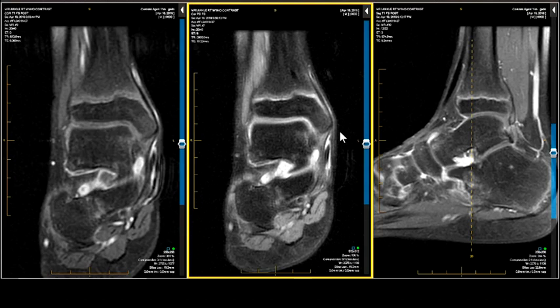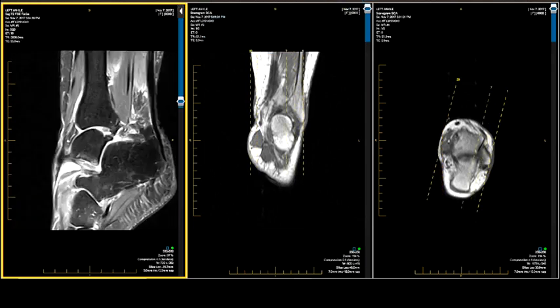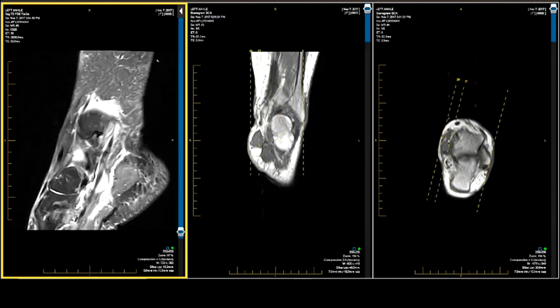But even then, I'd take it to your experienced colleague and say, is this synovitis, before I gave gadolinium. I really prefer not to give gadolinium to children. Brain tumor? Sure. You have to weigh, judgment. Medicine is judgment. I debated whether to show this to you because it's a kind of a complex case in terms of the findings.